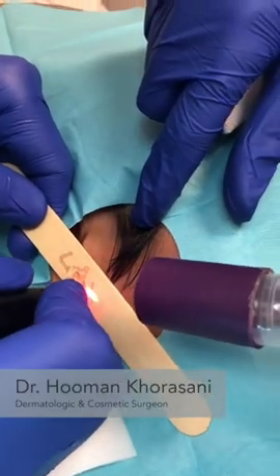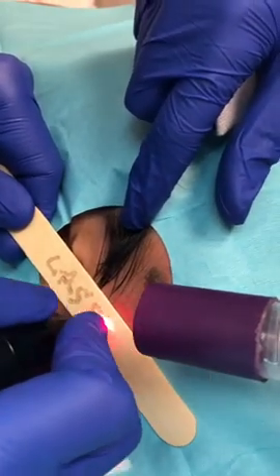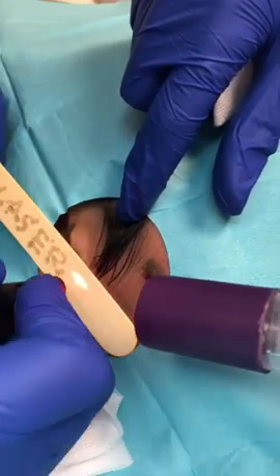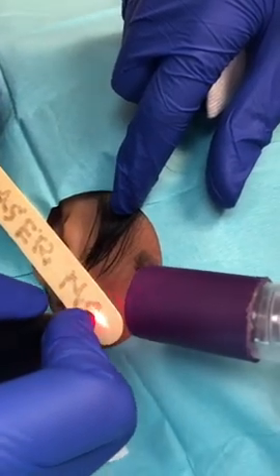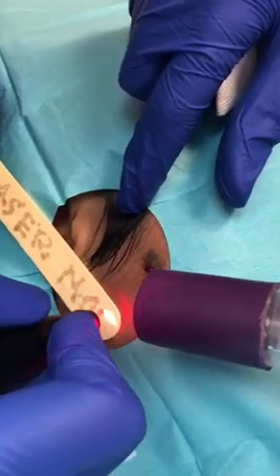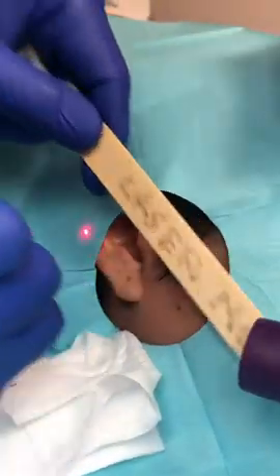Hi guys, Dr. Khorasani here. There are many different methods we use to remove moles. They typically include shave removal, excision, and laser ablation.